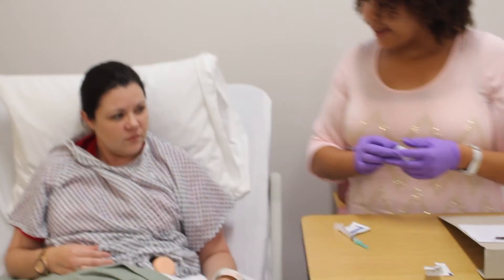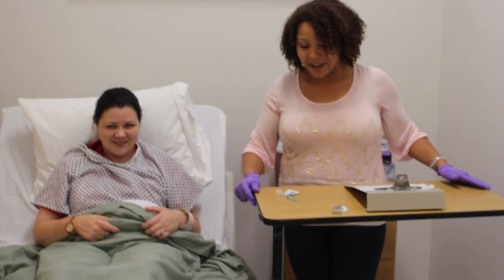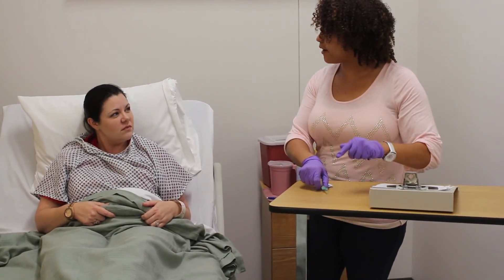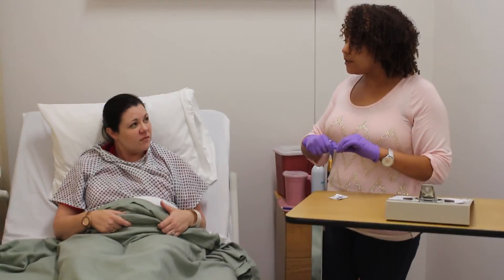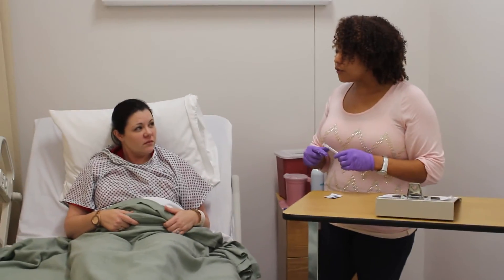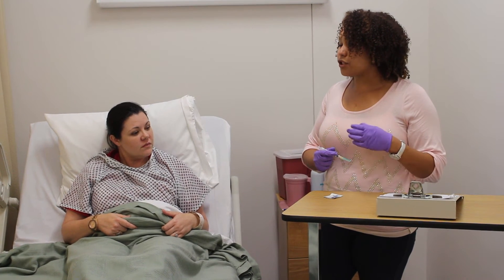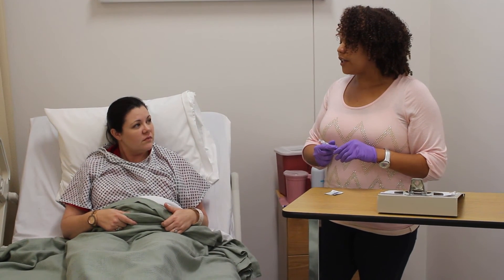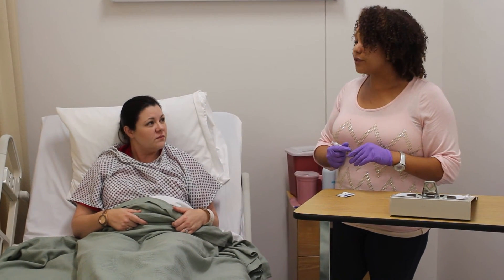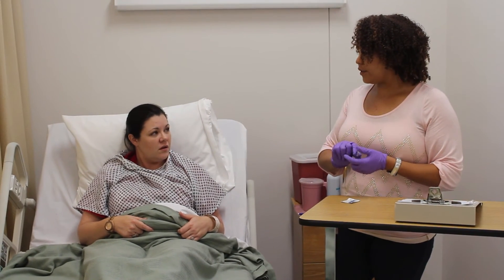Was that very painful? No, I didn't feel a thing — wonderful. Any other questions about the medication? There are some things to watch for: make sure you watch for any excess bleeding. When you brush your teeth, use a soft bristle toothbrush as your gums might bleed. Watch for any bleeding in your urine or stools, and any unusual bruising. Make sure you let your doctor know about any of that.